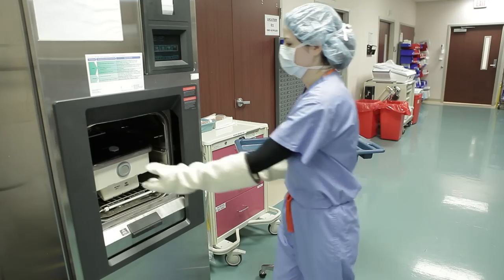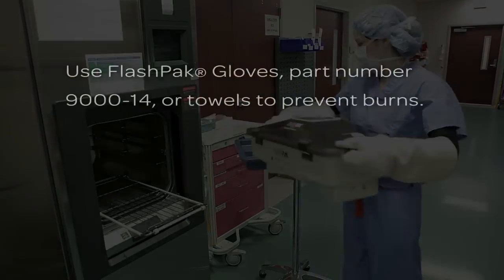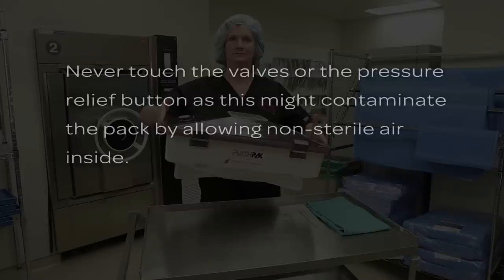After the sterilization cycle ends, open the sterilizer door and remove the FlashPak. The FlashPak will be hot — use FlashPak gloves, part number 9000-14, or towels to prevent burns. Do not handle or carry the FlashPak by the lid. Never touch the valves or the pressure relief button, as this might contaminate the pack by allowing non-sterile air inside.